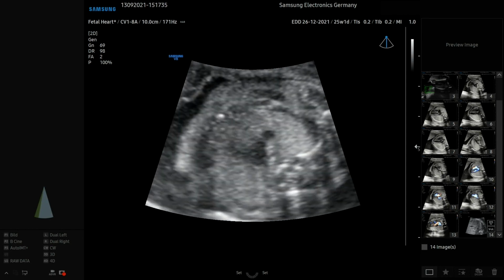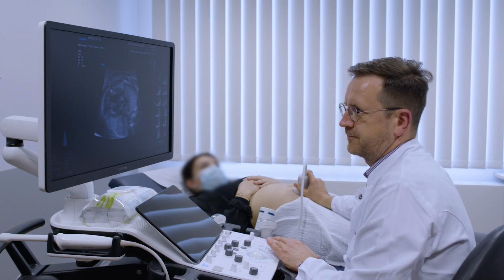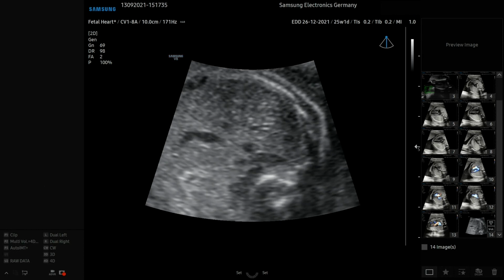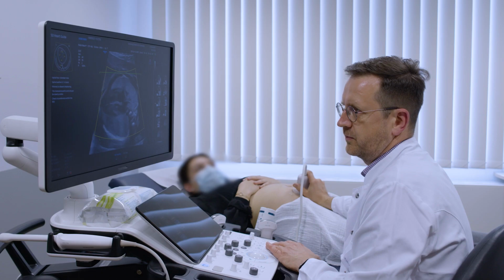Again, baby, be quiet. Excellent. So I save this volume again, and I'll show you the result immediately, but I will do another static volume, and I show you what it means.